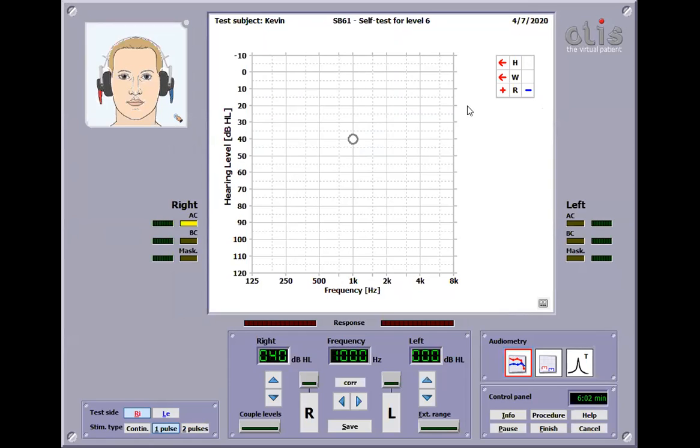Now, since it's the fourth video, I'm pretty sure everyone's pretty confident with the Hughson-Westlake technique. So I'll keep quiet for a while. Okay, that's our first ascending. Again, we need to try to make sure we're not being rhythmic. In real life, but here I do not give a hoot. I do, just not as much.